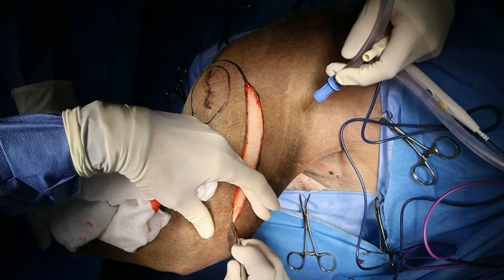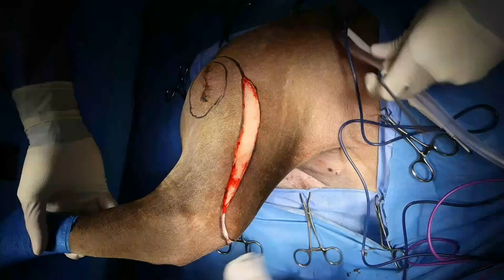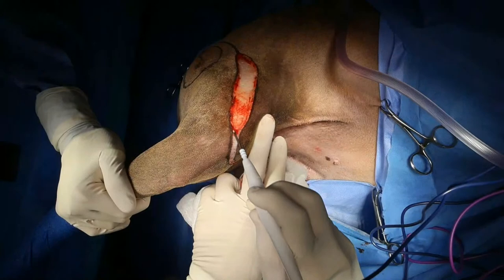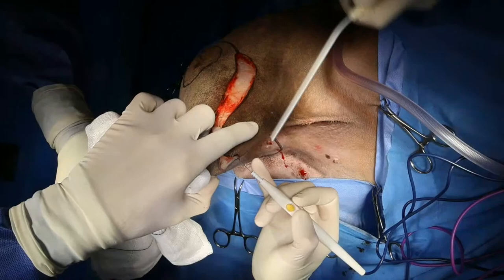So for those of you that are joining us late, we've got either a chondrosarcoma or a chondroblastic osteosarcoma in the proximal femur in this Rhodesian Ridgeback. And so we're having to excise that biopsy tract. And so I'm harvesting a flank fold flap before I do the hemipelvectomy. And that's going to be used to close our defect.